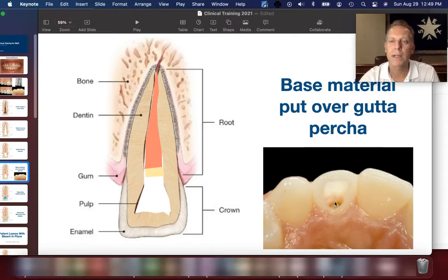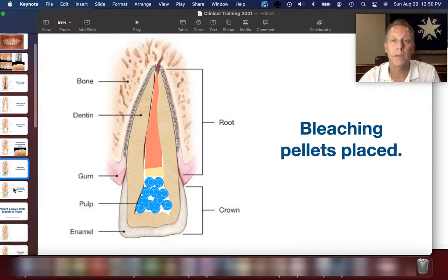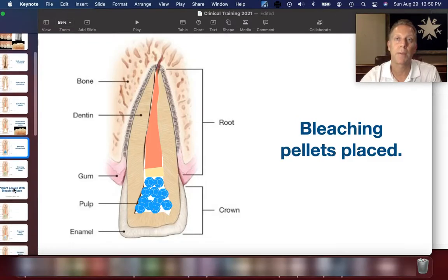This is what it looks like clinically inside. If you look inside the hole of the tooth created for the root canal, you can see the entire pulp chamber has been cleaned out, and there's a little bit of base material placed on top of that orange gutta percha. We then put bleaching pellets inside — this is going to be sodium perborate. We smash it up and try to make those pellets into small little pellets, and sometimes it comes in a paste.